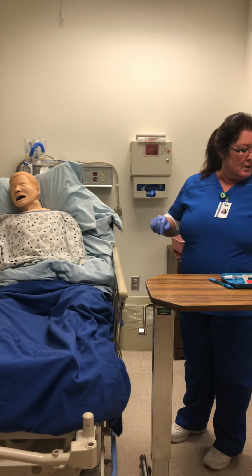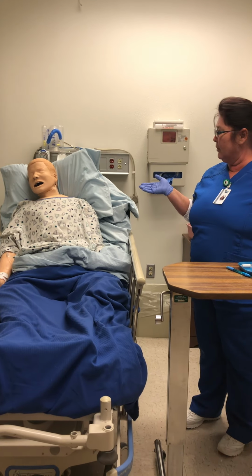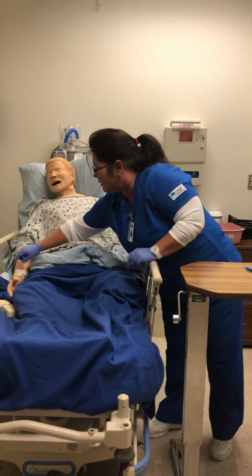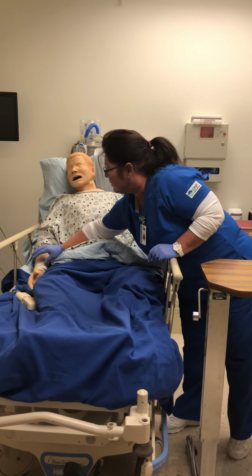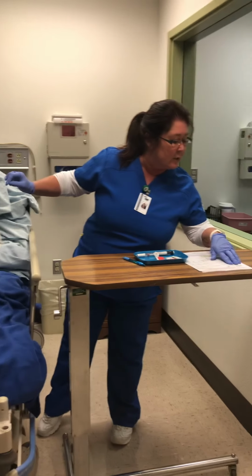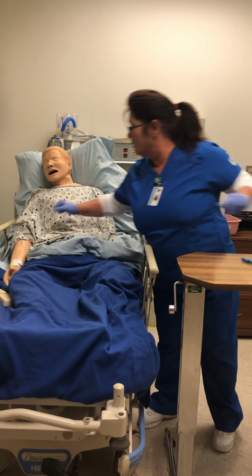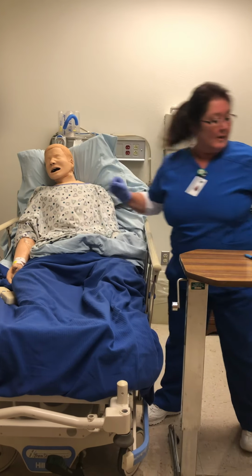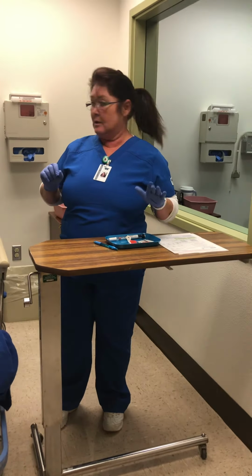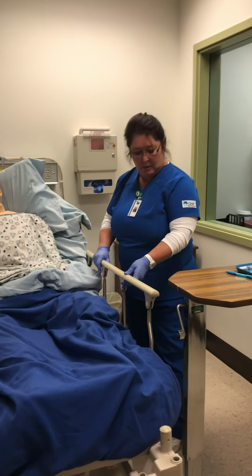And I'm going to double check with Shirley her name and date of birth. If you could please tell me your name, date of birth. Shirley Cost, 5/14/1964. That does match on her wristband, as well as Shirley Cost, 5/14/1964. And Shirley, do you have any allergies? Codeine? That matches the wristband, and that also matches my MAR. Perfect. So I know that what we're giving her has no codeine in it, so we're good. I am going to lower her bed rail.